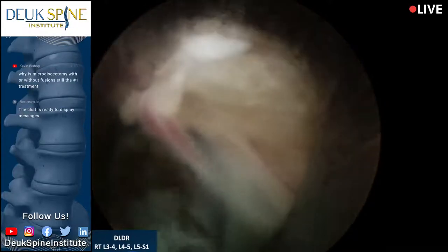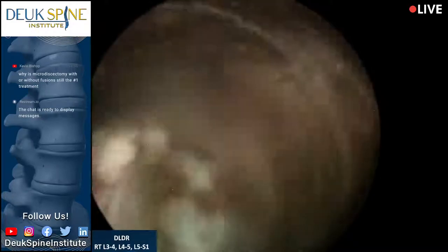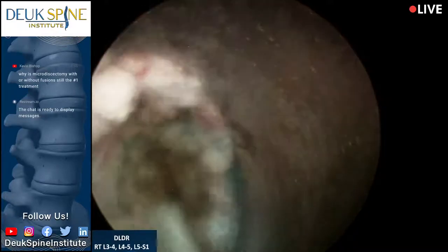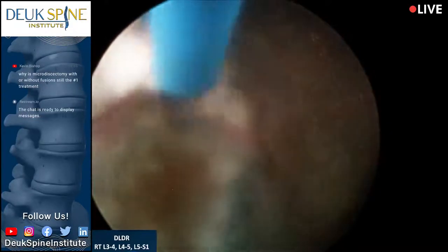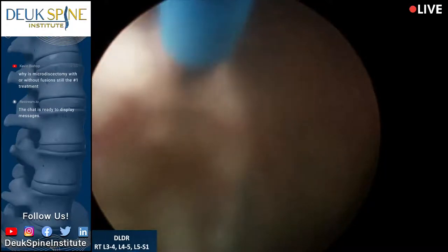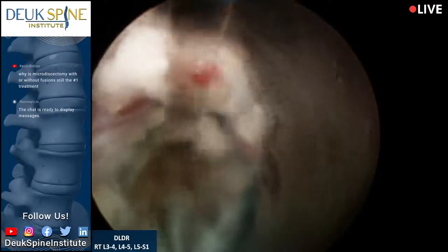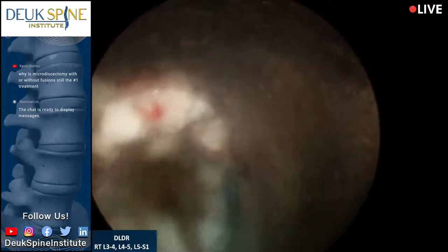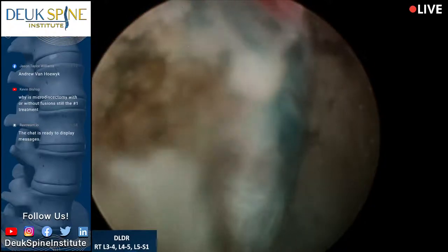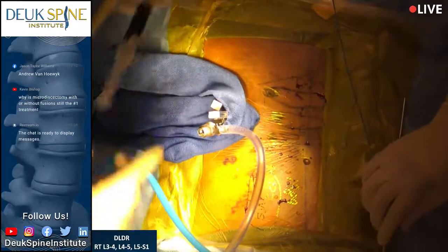You can probably see the nerve root up here. It's kind of buried in the fat. But overall, I'm happy. We got a lot done. You can see a lot of blood vessels. Anybody know why we have blood vessels here? Do you guys remember what I taught you? Remember, what's the process causing his symptoms? Inflammation. And what does inflammation for 30 years look like? Well, what it does is it creates these tributaries that bring blood to the disc so the inflammation can keep going. So you'll see in inflamed areas of the body more blood vessels there bringing blood, because you need blood flow for inflammation to happen.